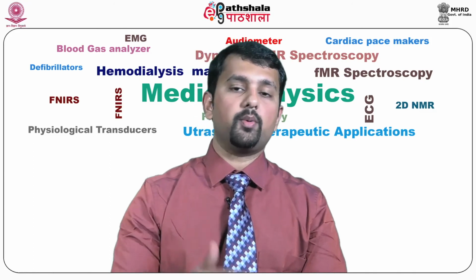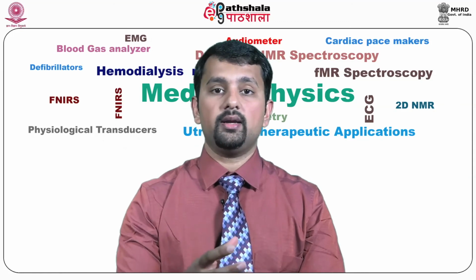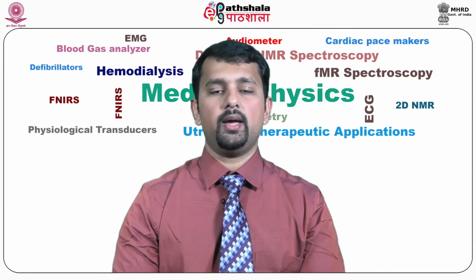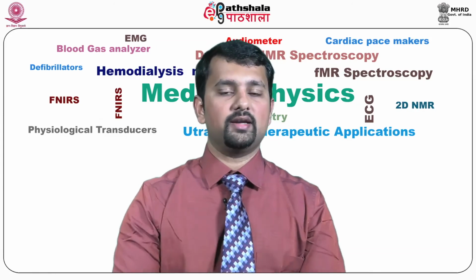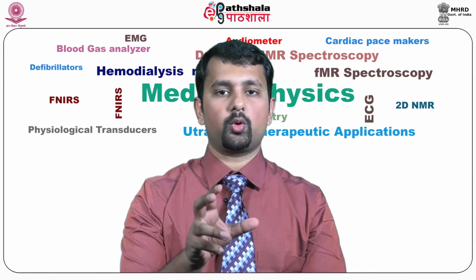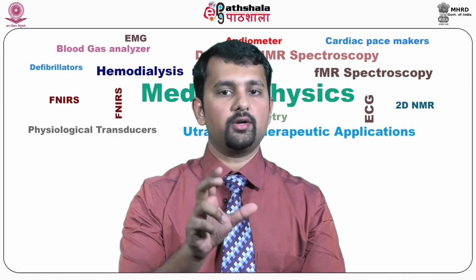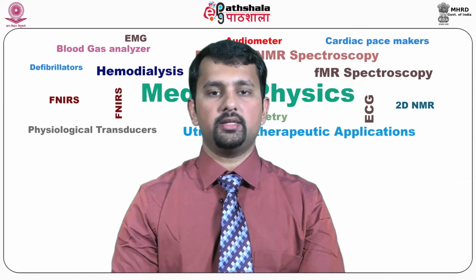So, what is more important in focal liver lesions is to assess the choline through phosphorus MRS than proton MRS. So, phosphorus MRS is coming up in a big way to assess the choline levels in focal liver lesions as compared to proton MRS. The role of proton MRS in focal liver lesions is less, it is difficult to obtain, it is quite challenging. So, we will not go into the depths of that in this module.